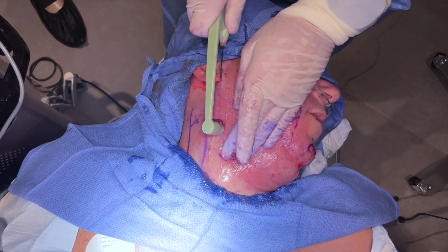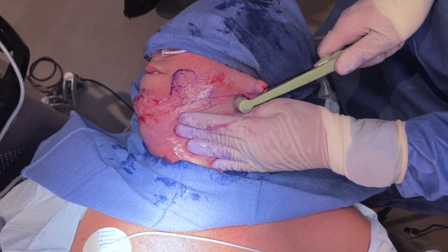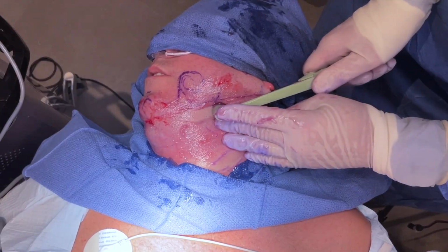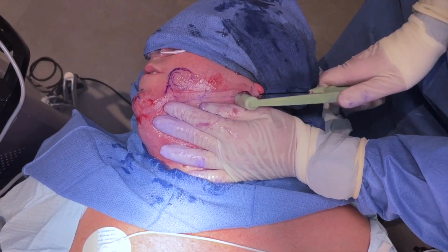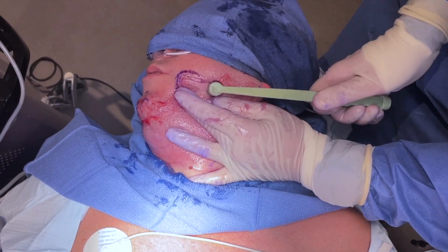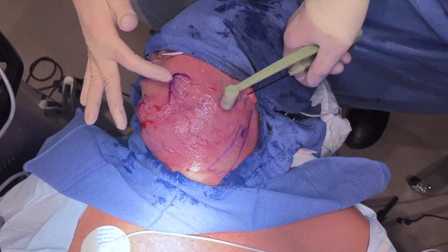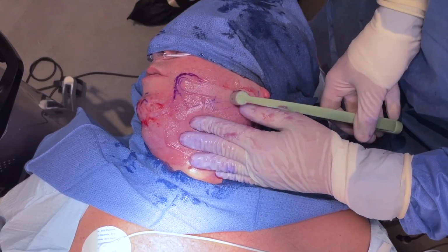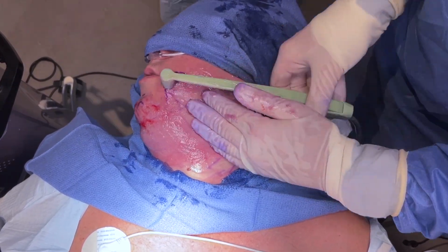So as you can see, each spot typically gets 3 passes. At that point, with most of my patients I can feel that the external and the internal temperature limits have been reached. So at that point, I know that we're not going to get more energy. So then I go a little bit down the neck. Again, we do 3 in a row, 3 in a row, and so forth.